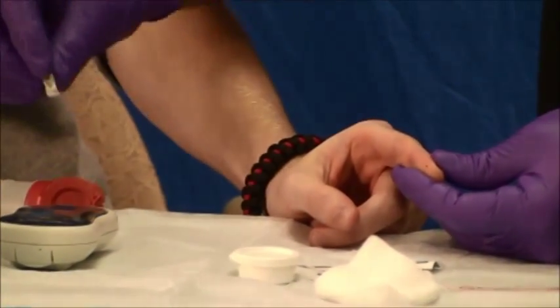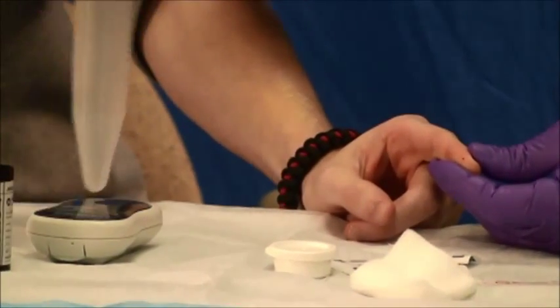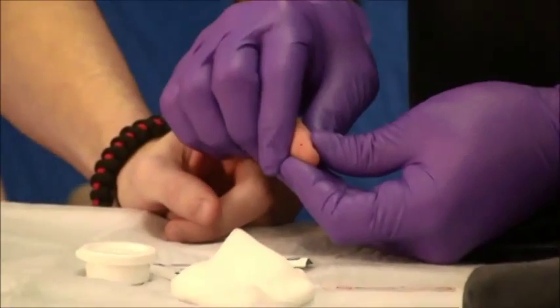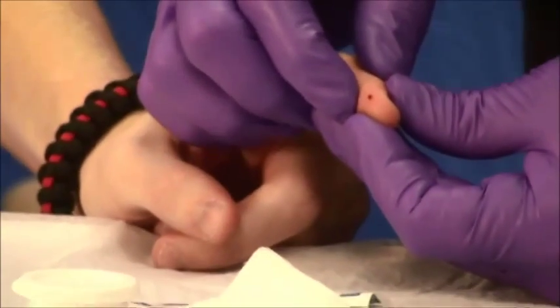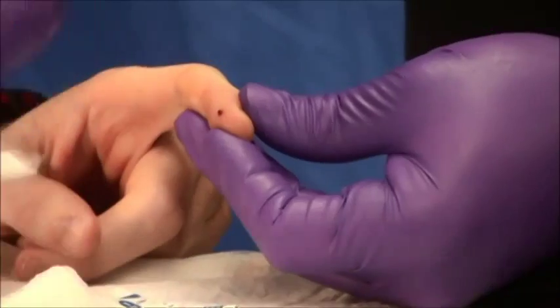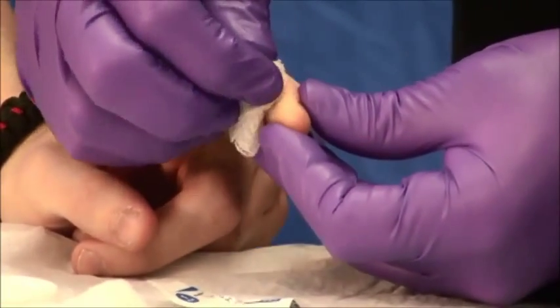If you're able to, immediately dispose of your sharp. Slightly squeeze or milk the pad of the finger. So as not to have a contaminated sample, wipe the first drop of blood off.